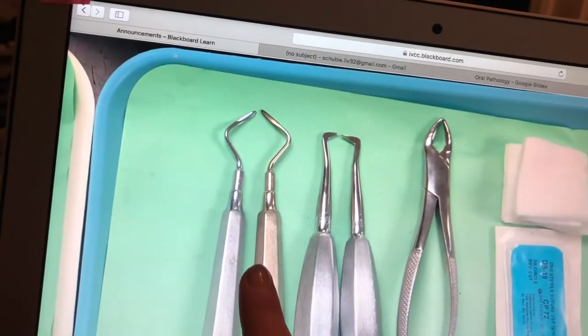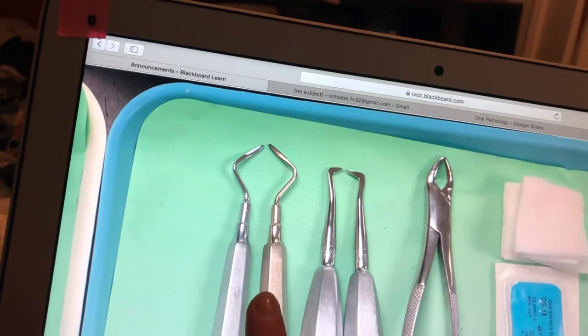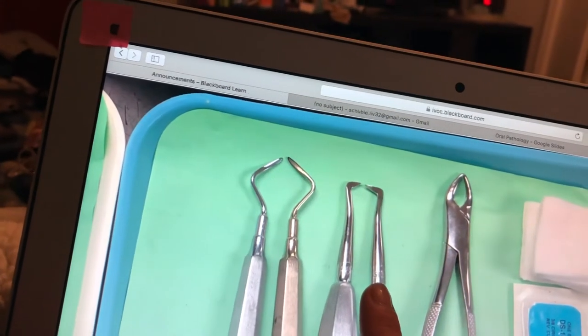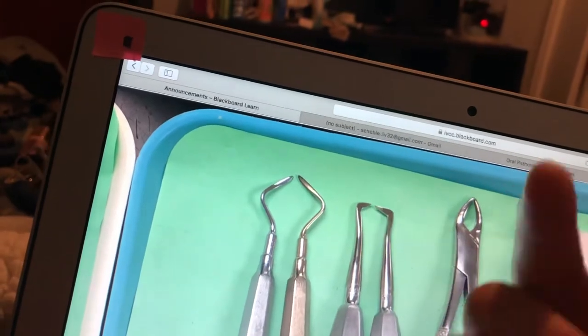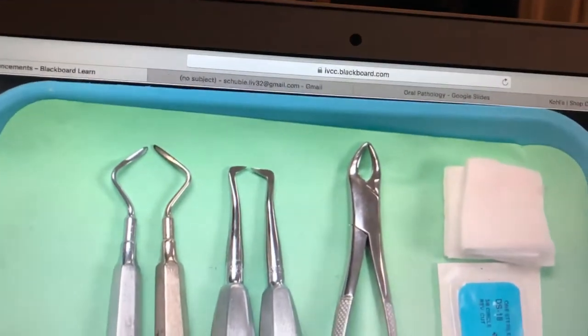We've got the left and right root tip elevators, and those are going to be used to lift and remove the fragments from the roots. Then these are the right and left root elevators, and those are going to be used to loosen the root and then lift it from the socket.